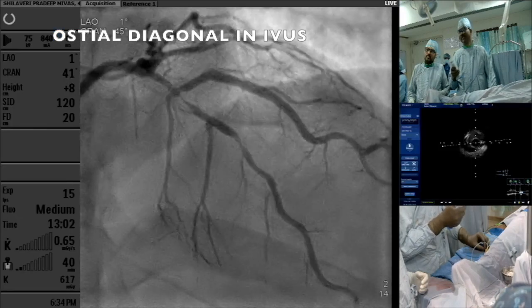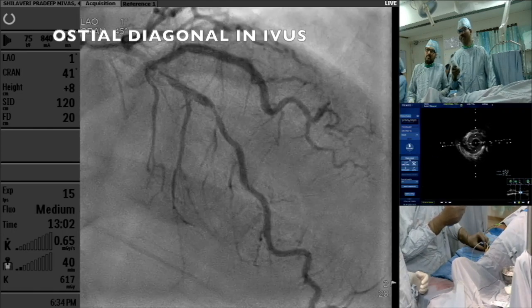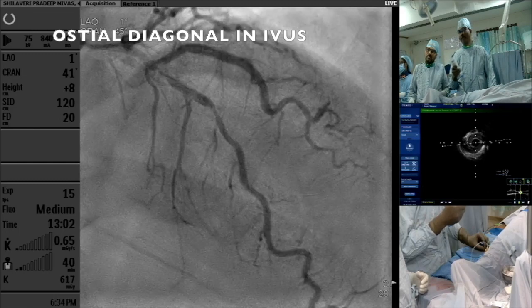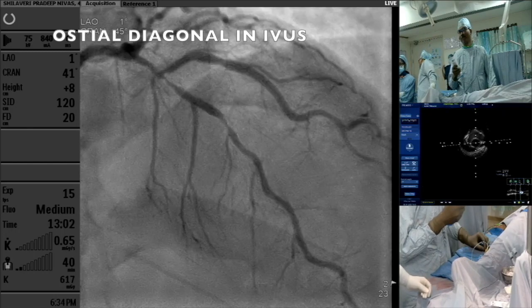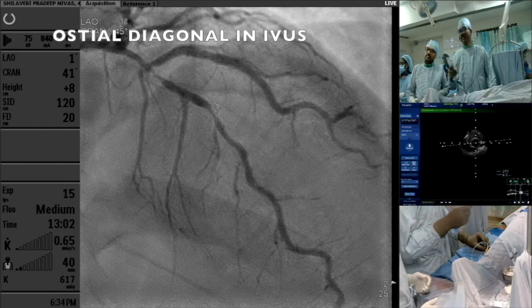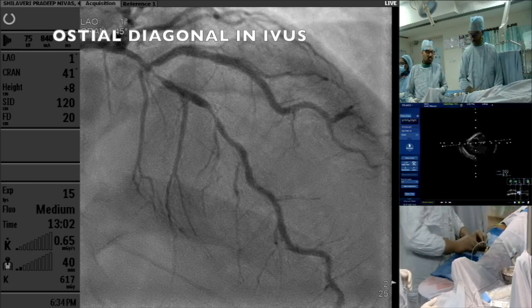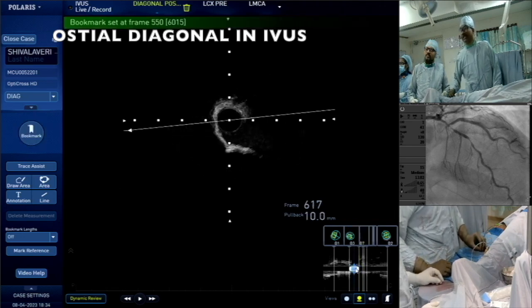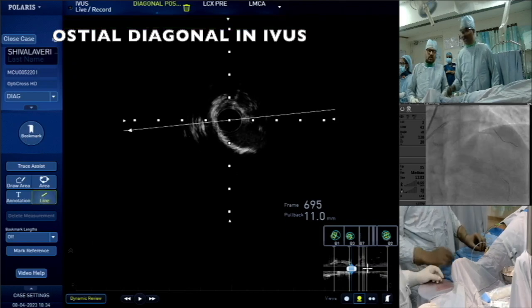Yes. So here, sir. The dissection area. Yeah. So 30 degrees. So man, this is like a gray zone. If you want to avoid the two stents, you can leave it and move on to provisional side branch stenting. And if there is any issue again, you have to do either TAP or T based on the angle. Okay.